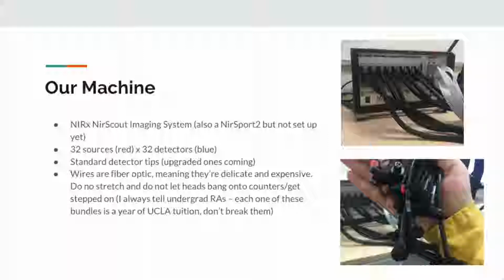They are standard detector tips right now. We're going to be upgrading the ones we have shortly, but that doesn't really matter for you guys when you're collecting data. That's just something to know that if Matt ever puts you in charge of operating the machinery and looking after components and stuff, just know that the upgraded detector tips are going to have higher dynamic range and things like that.